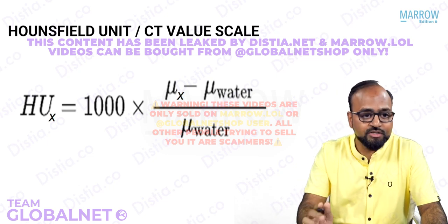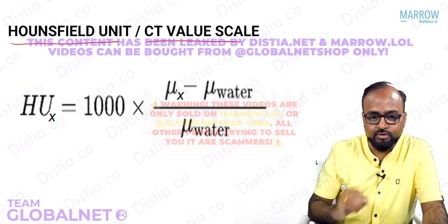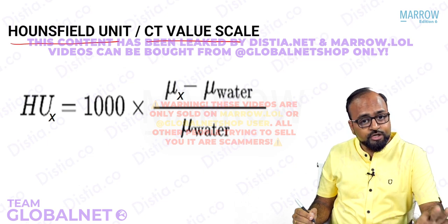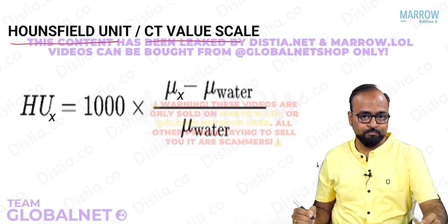Now, let us quickly discuss what is this Hounsfield unit scale or CT value scale. Now see, on a CT scan image, each and every tissue in the body is given a numerical value.